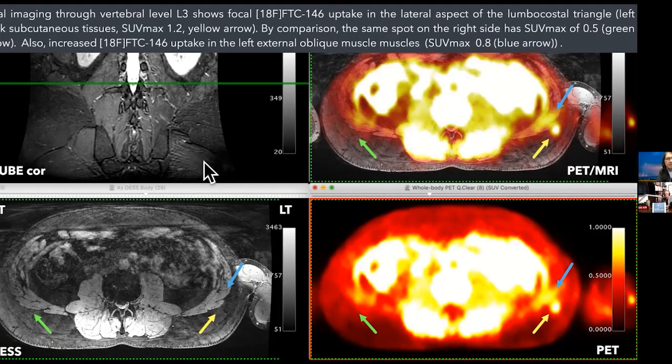And then here are MR images through the trunk. So still at the level of the lumbar spine, but now going out more laterally to where he was describing some pain. This is a coronal view through some of the soft tissues. One of the things I haven't really said is how often the MR is negative, even on the MR that we perform in areas that we're looking at. So where this yellow is pointing out will ultimately, of course, be where the PET is positive. But if I look very carefully, I don't really see anything abnormal on the MR.